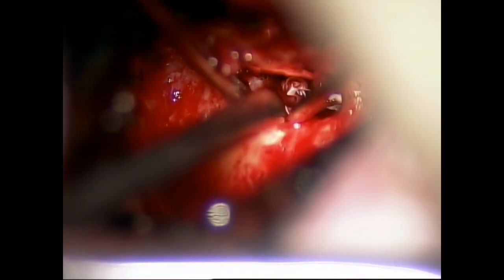So I'm putting it in first, just as I did in the past. Make sure it's not too small. So now I've got it in position, and then we're going to check, and it seems pretty nice. Seems pretty good. Now we'll take a look at its position on the undersurface.